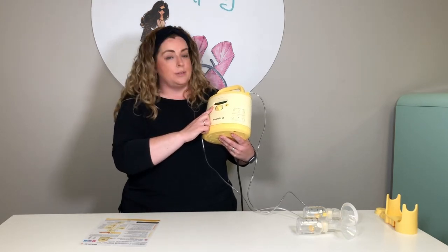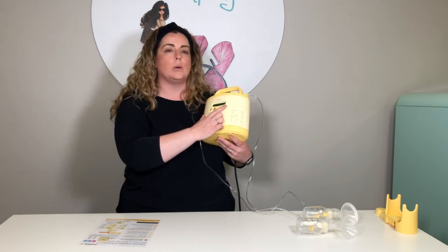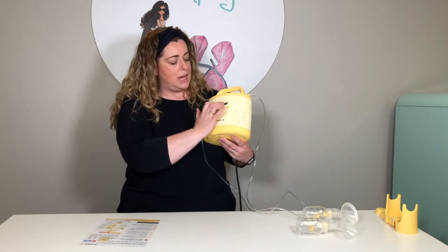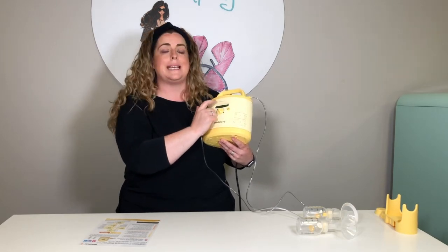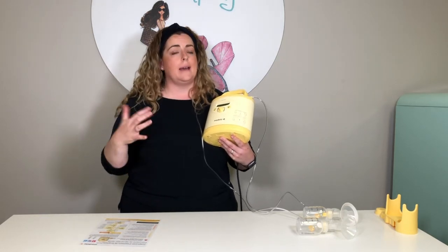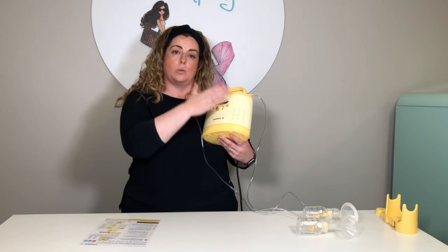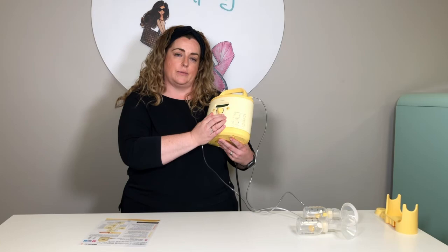So I'll turn it off again, turn it on, and now I'm not going to press the initiate button, I'm just going to let it run. And after a few seconds, the press initiate prompt is going to disappear, and now it's going to tell me that maintain is running. So maintain is where you have established your supply and you're now wanting to maintain and build your supply. So remember that once you've decided whether you need the initiate or maintain, then you adjust the level of suction.